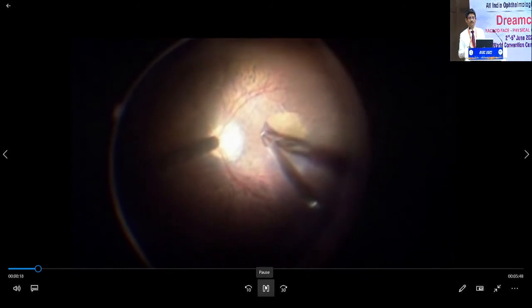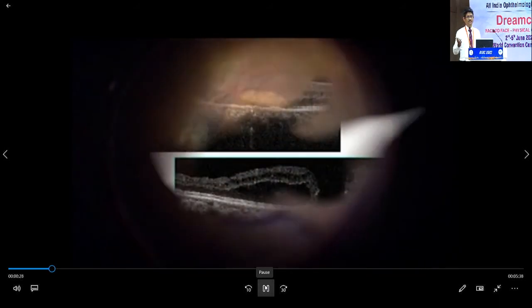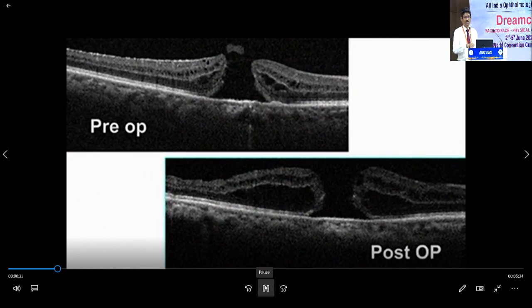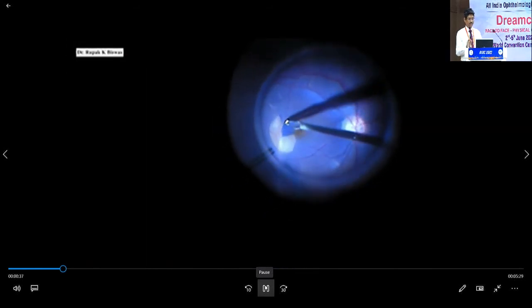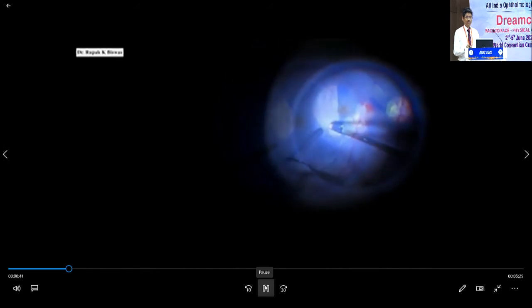This is a routine macular hole surgery. When you are doing macular hole surgery with standard ILM peeling — adequate amount of ILM peeling — most of us, if the macular hole is less than 400 microns in size, usually do a standard ILM peeling across the hole. But when you have a larger size, then you try to do the inverse flap technique so that your success rate goes up. This inverse flap technique definitely helps.